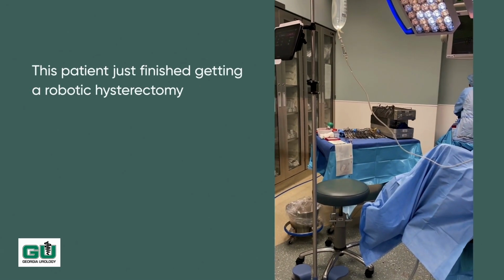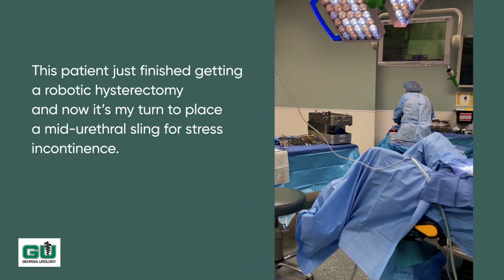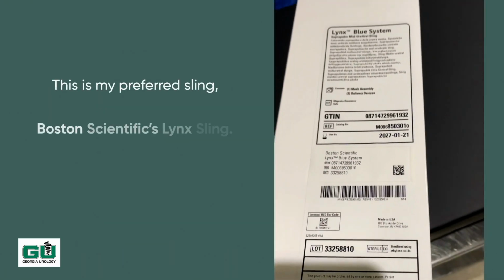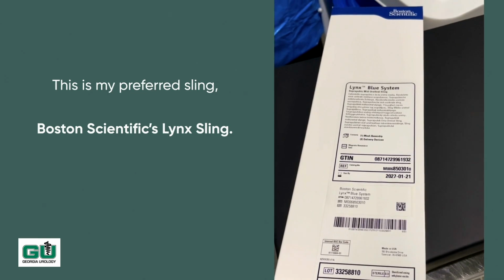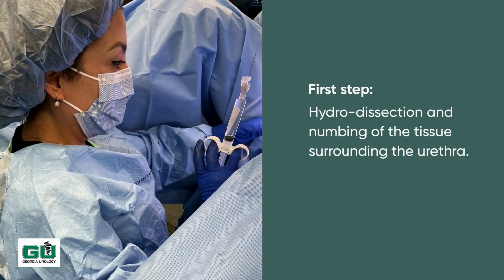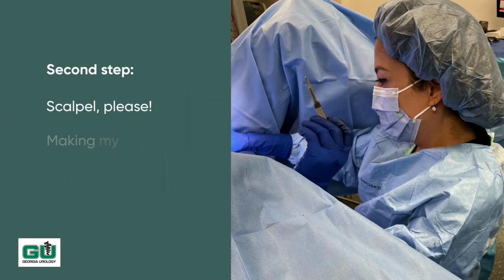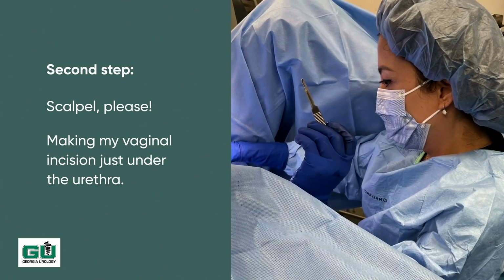This patient just finished getting a robotic hysterectomy, and it was my turn to place a sling for stress incontinence. My preferred sling is the Boston Scientific Lynx. First thing I have to do is inject some numbing medication around the urethra. Then I make a 1-inch incision in the vagina under the urethra.